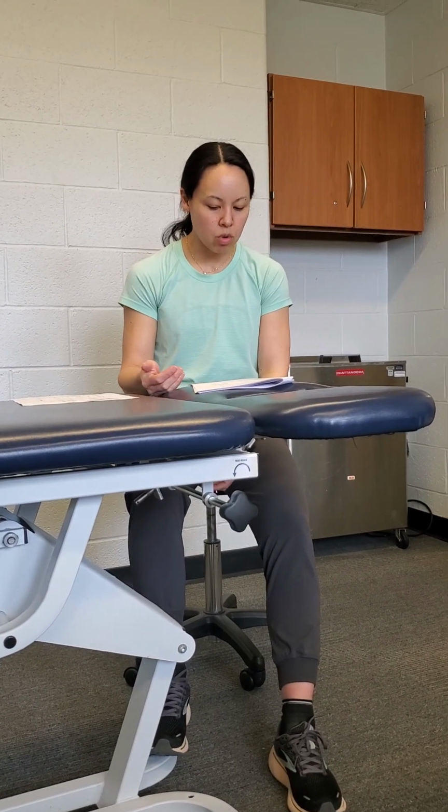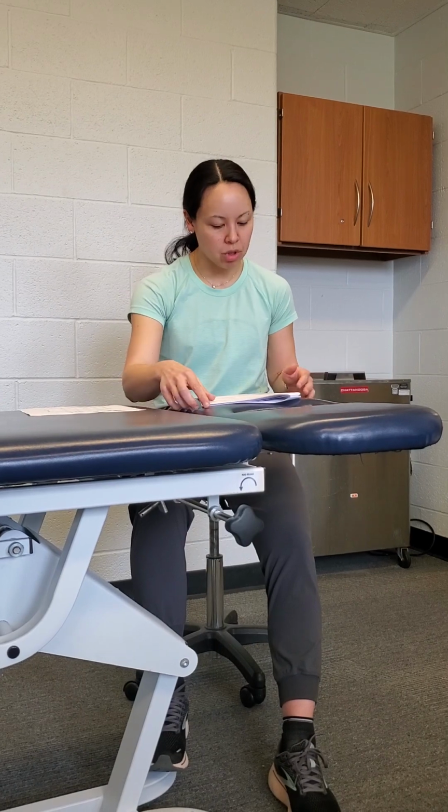Resistance, you can do single joint or multi-joint. Single joint would be your knee extension machine, versus multi-joint having them do a squat or a lunge while they have the cuff on. And then for passive, it's really just ischemic preconditioning, and it's muscle sparing. We're not really trying to build muscle at that stage. We're trying to reduce the muscle atrophy that's occurring after their surgery.